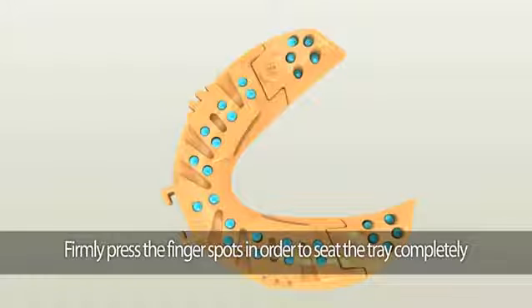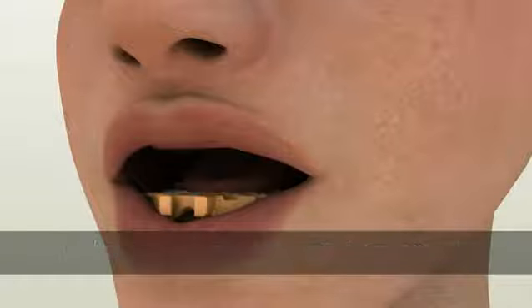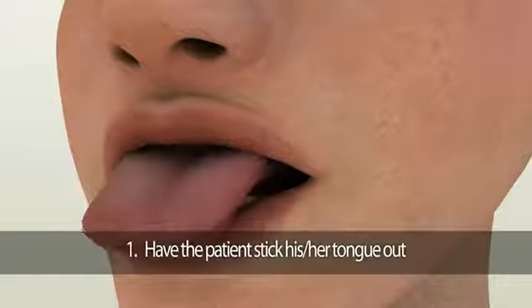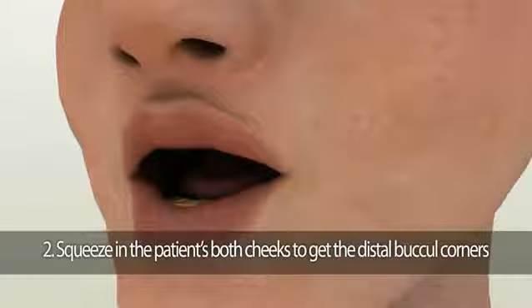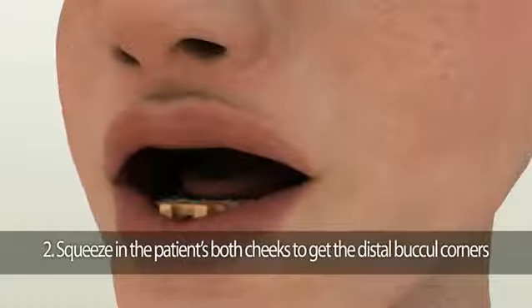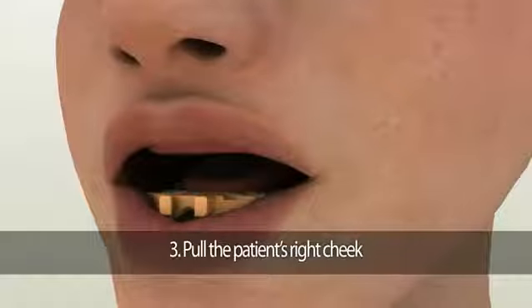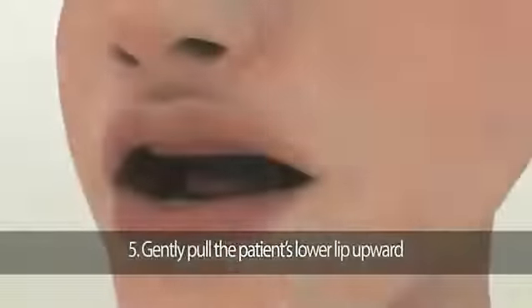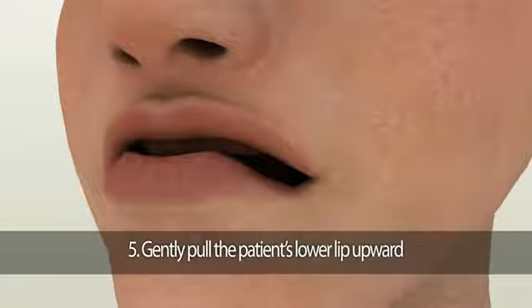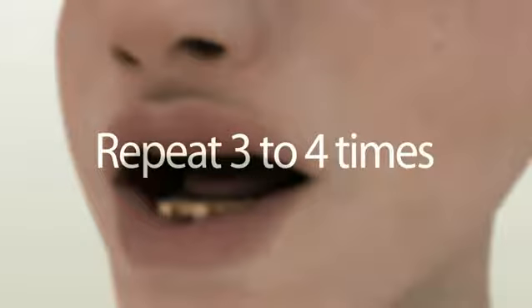To help with complete seating of the customized Dent Cut tray, there will be finger spots on the back of the tray. Firmly press the finger spots at the back of the tray. Once the tray is seated, perform border molding procedures. First, ask the patient to stick their tongue out and then towards the corners of their mouth. Second, ask the patient to say 'oh' to squeeze in both cheeks to capture the distal buccal corners. Third, pull the patient's right cheek, and fourth, pull the patient's left cheek.